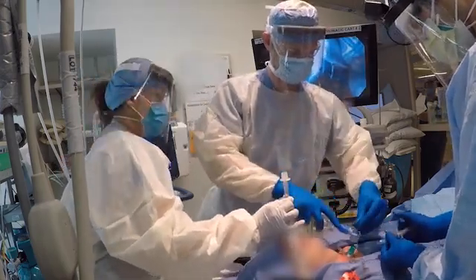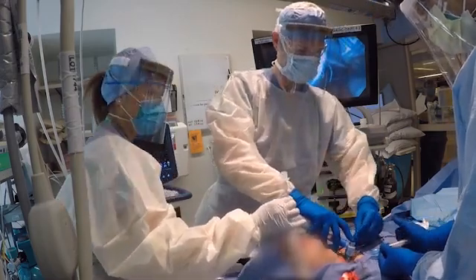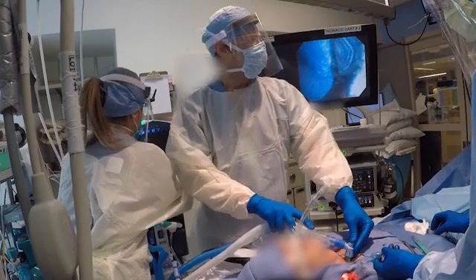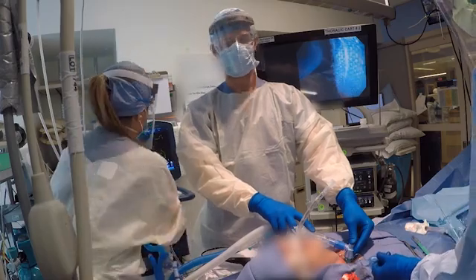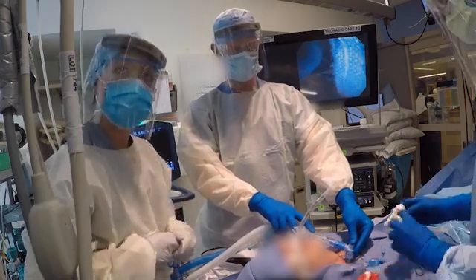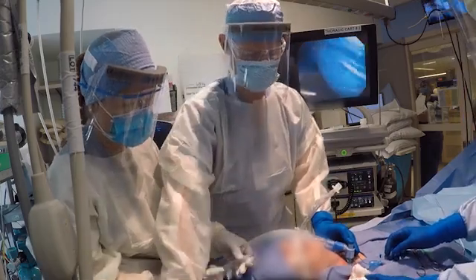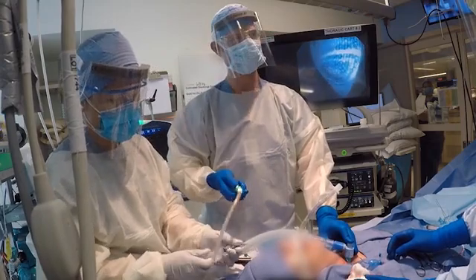Inflate the tracheostomy cuff, connect the circuit to the tracheostomy tube, and resume ventilation. The presence of end-tidal carbon dioxide confirms placement in the airway. Alternatively, the bronchoscope can be reinserted through the tracheostomy tube to visually confirm placement within the airway. Once satisfactory placement is confirmed, secure the tracheostomy tube with a tracheostomy collar. If a purse-string suture was placed, tie down the suture to close the skin incision around the tracheostomy.